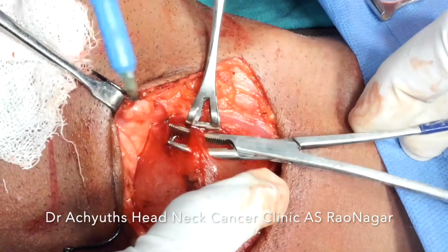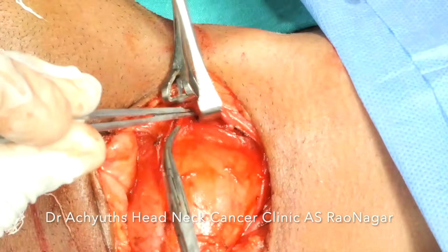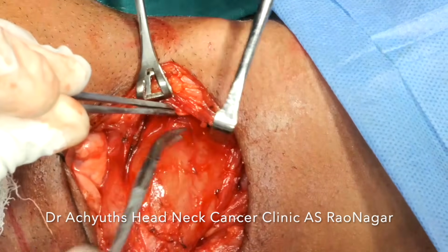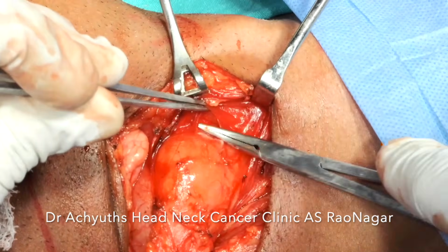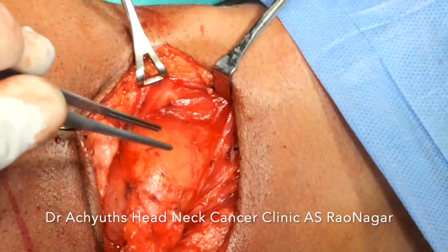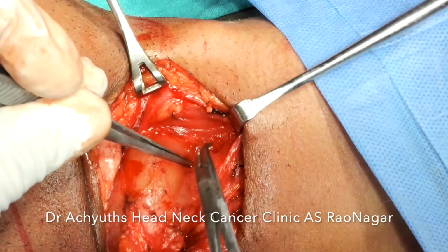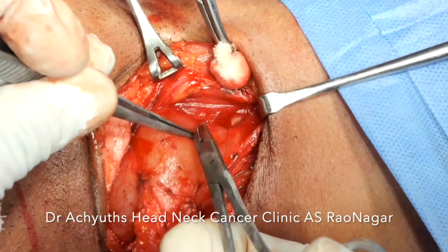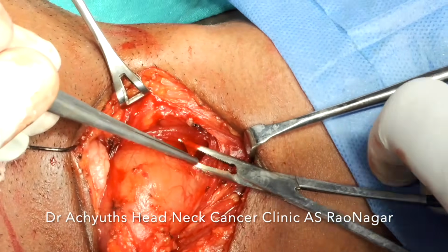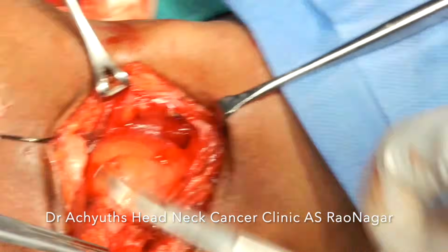The key skill that we require in delivering such a cyst is having patience, because ultimately it will be delivered, but how many of the important structures we have preserved while dissecting this out is very important. So rather than directly dividing all these muscular structures here, I'm just trying to see what vascular plane I can get through and divide it from the cyst attachments.